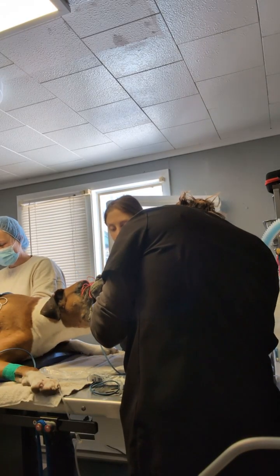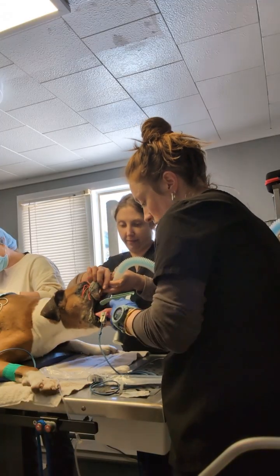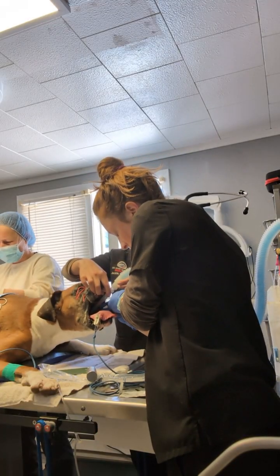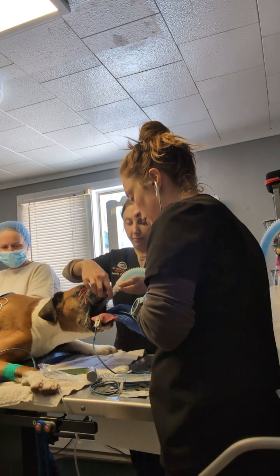Oh, I see it. It's very easy when you have it placed in the right area. So I'm just going to pass it in to where I measured it. Attach the stethoscope firmly. Make sure I can hear the heartbeat.